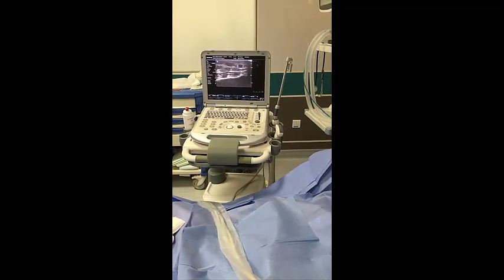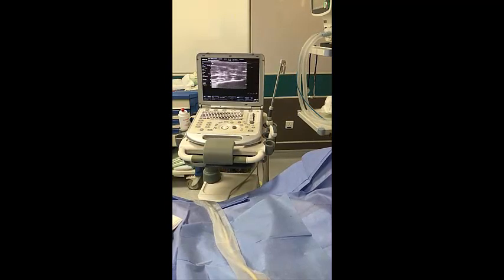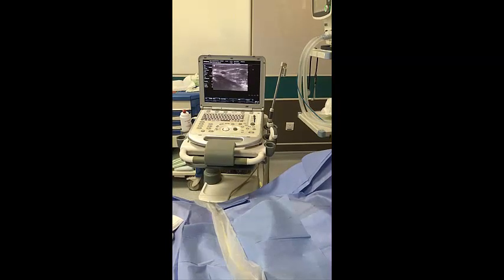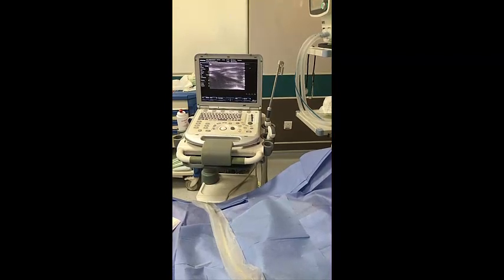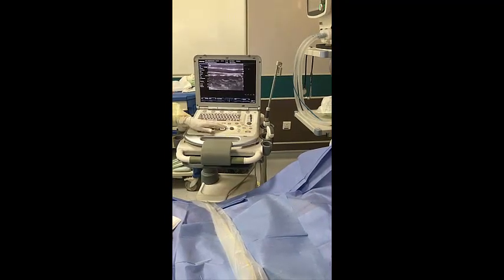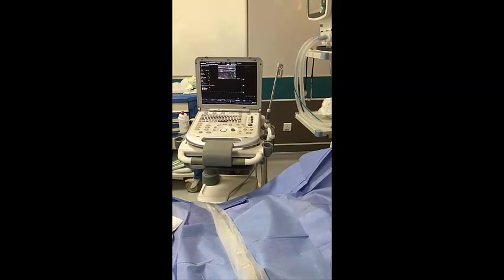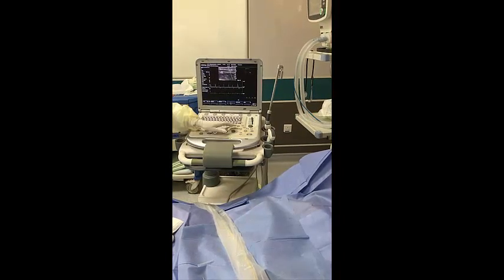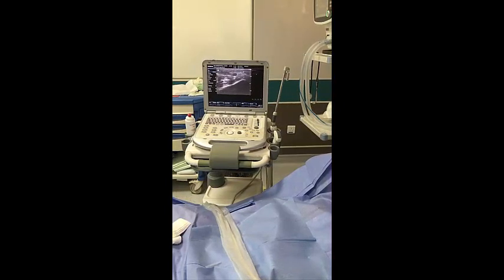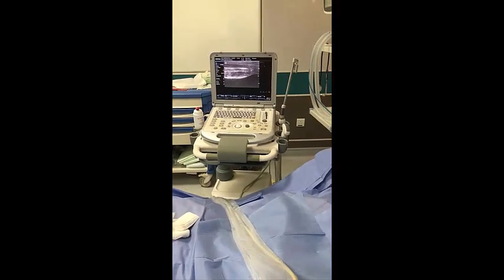This is the first step. One of the most important parts of inserting an arterial line with ultrasound is that you can check the ulnar artery and confirm it is working properly before cannulating the radial artery. You can see the ulnar artery is pulsating well. I will check the pulsed wave of the ulnar artery — please do the pulsed wave. You should check the ulnar artery by ultrasound before starting on the radial artery.